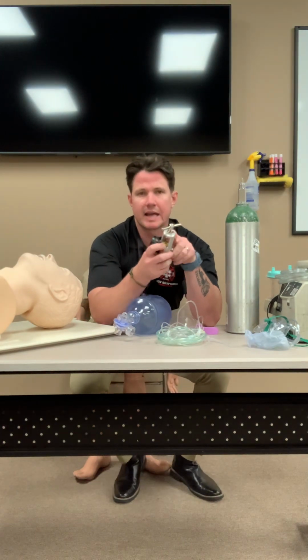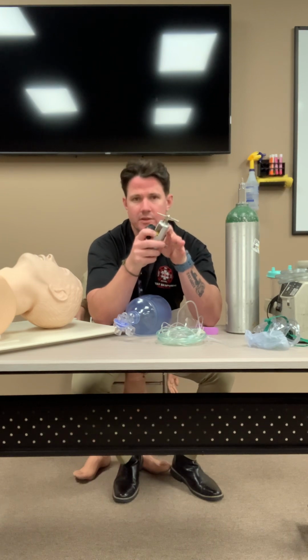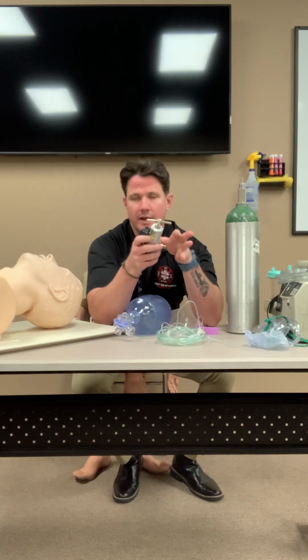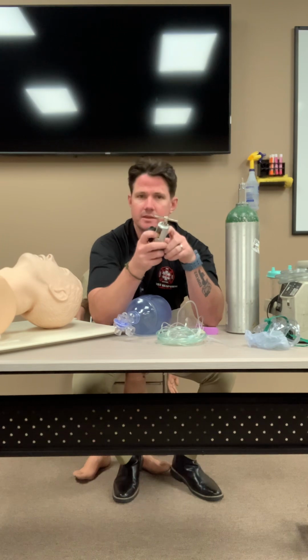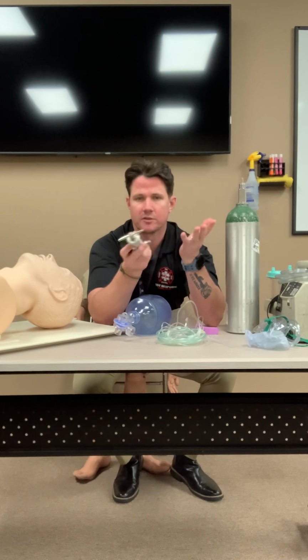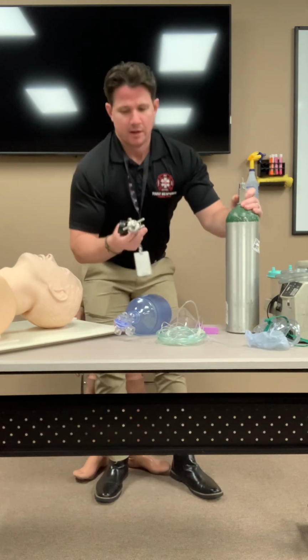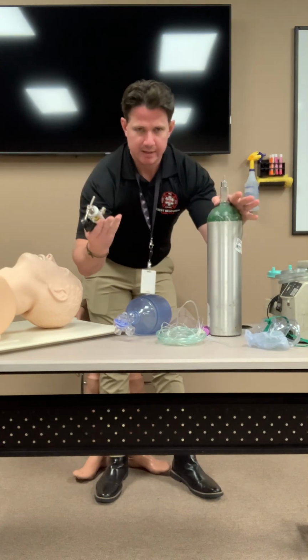If you do not have that gasket present, when you connect this to the tank and then open up the cylinder, it will bleed. It will leak. So we want to make sure that is there as well. I know I went over this with you guys, and you all seem to have a good understanding of the pin index safety system.